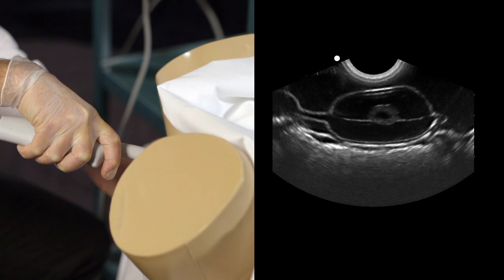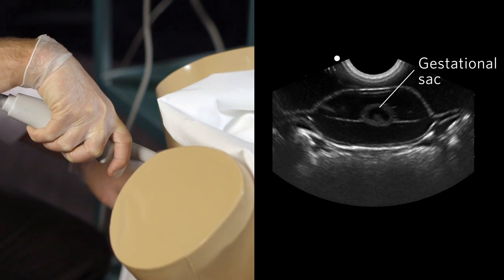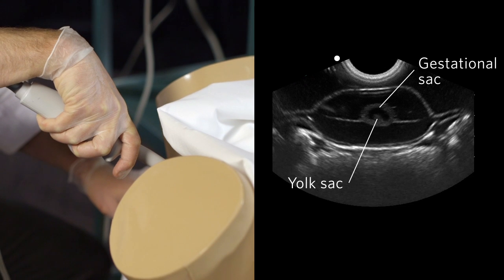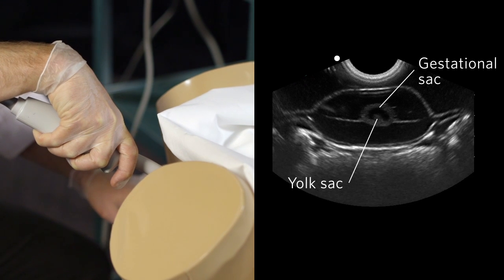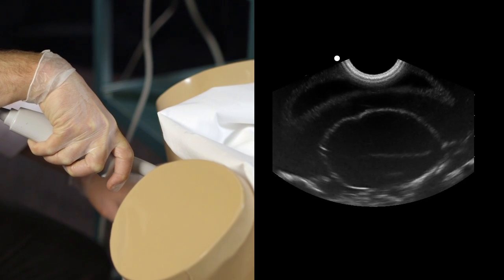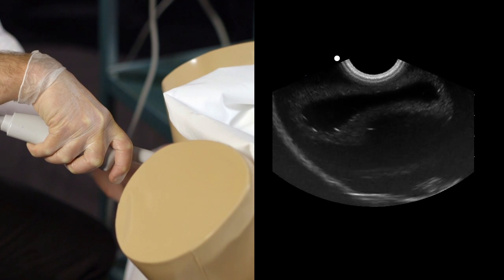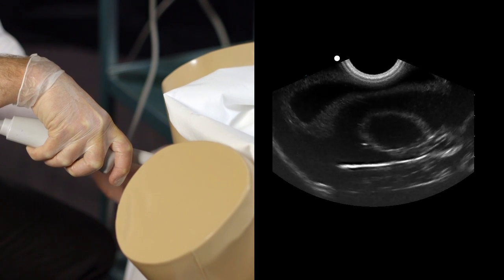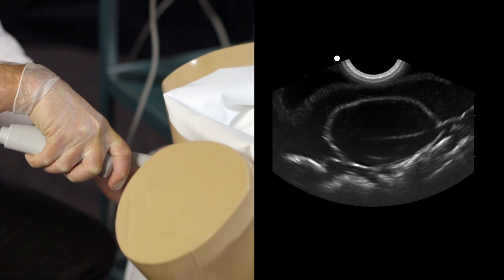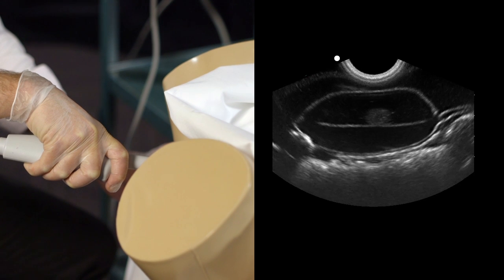To diagnose an intrauterine pregnancy, you again need to see a gestational sac and a yolk sac and ensure it is contained within the uterus. If you do not see these findings, you cannot confirm an IUP — your diagnosis is thus no definitive IUP. If you see a beating heart within the uterus, you can confirm a live IUP.